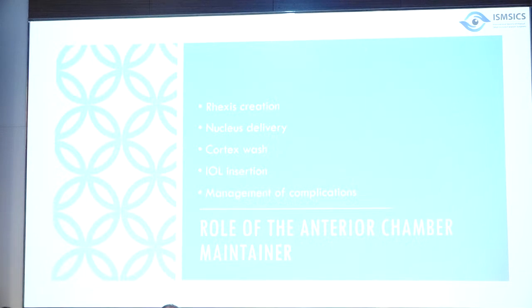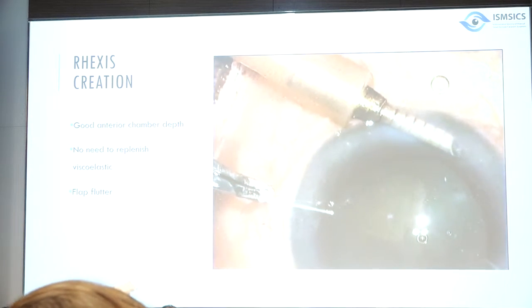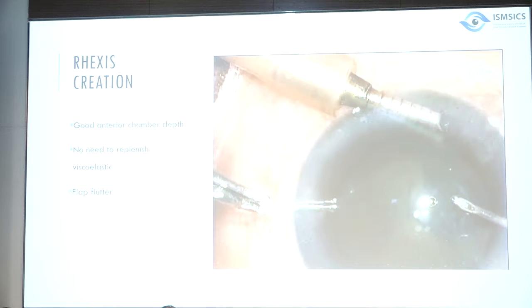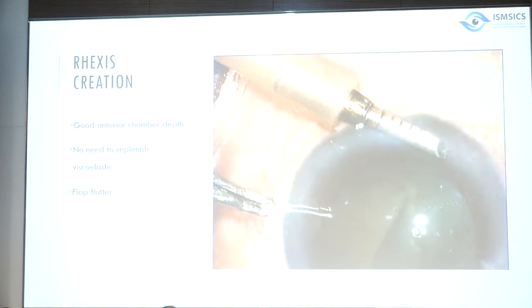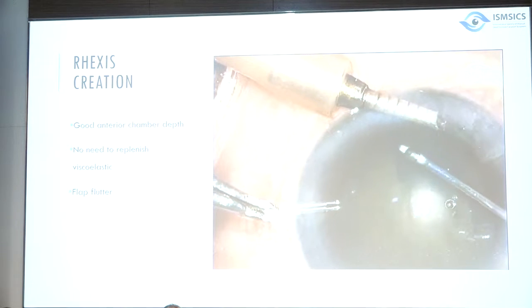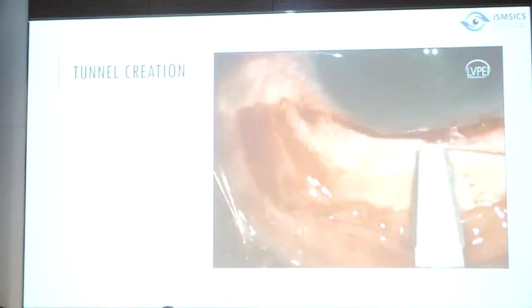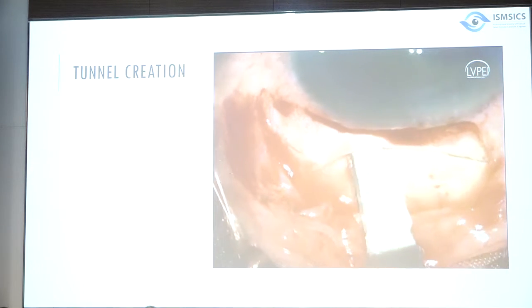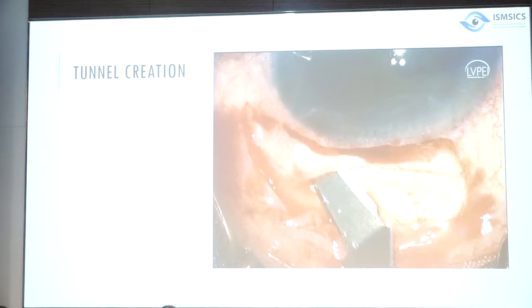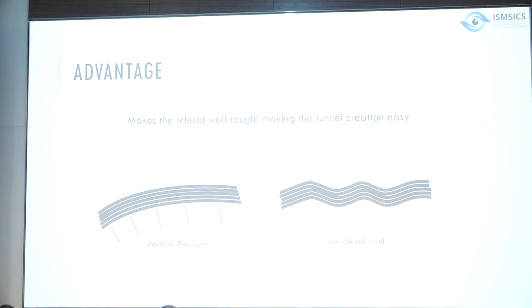The AC maintainer can be used during capsulorhexis — eliminating the need to repeatedly inject viscoelastic. The flap tends to flutter near the maintainer but keeping it flat on the anterior capsule yields a good rhexis. During tunnel creation with the AC maintainer on, you get good tunnel depth and the globe does not soften. The AC maintainer keeps intraocular pressure positive, preventing lax scleral wall during tunnel creation.